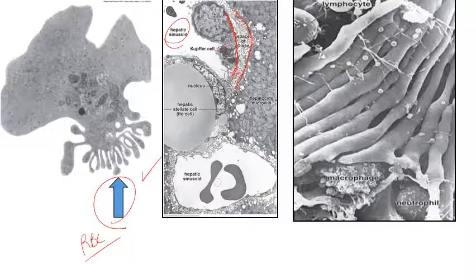You'll see here the hepatic stellate cell, which you'll learn about later on. And we have a great picture of our hepatic sinusoid right here with our space of Disse underneath, or inferior to, the red line. And that's going to be our apical modifications of the hepatocyte. So this is the hepatocyte. This is the hepatocyte. This is the hepatocyte. This is a red blood cell. That's a red blood cell. That's an artifact. I don't know what that is.